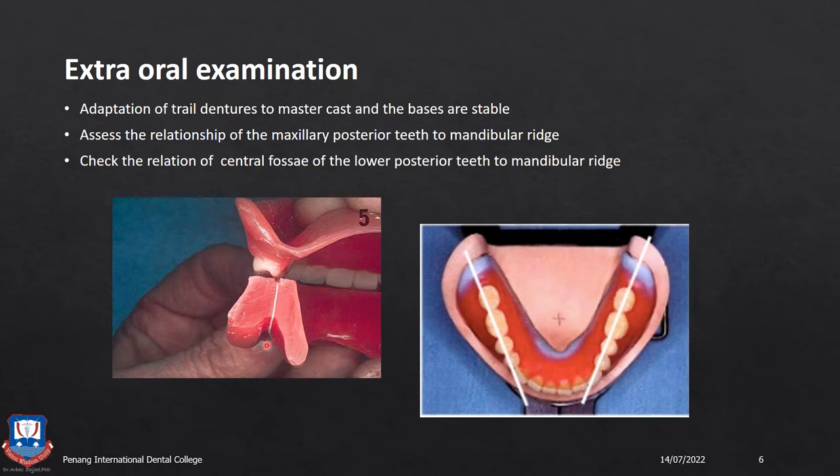You need to verify whether there is any wax or any dirt or debris underneath the denture, whether there are any sharp edges that may hurt the patient or make him uncomfortable. All these things, and the proper sculpting of the wax, whether it is smooth, whether the cameo surface and the intaglio surface meet each other smoothly. It should meet like a fish belly.